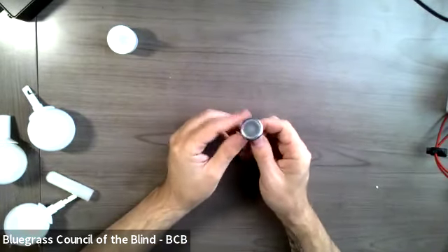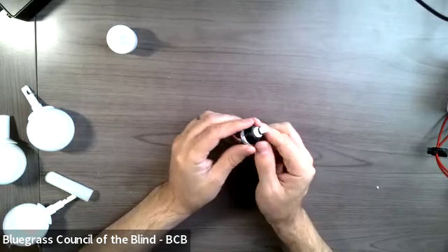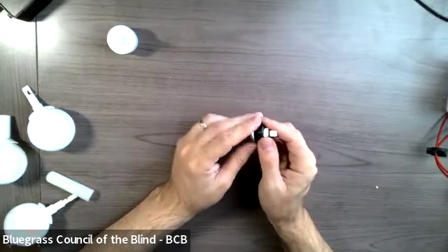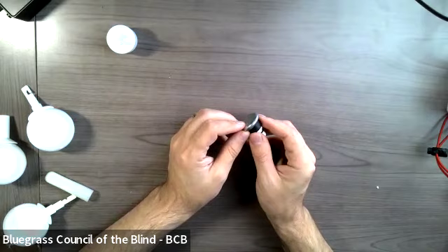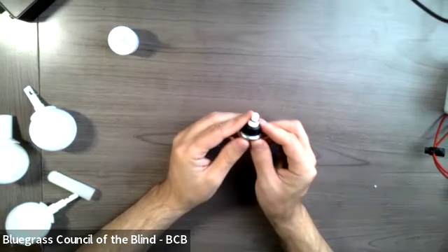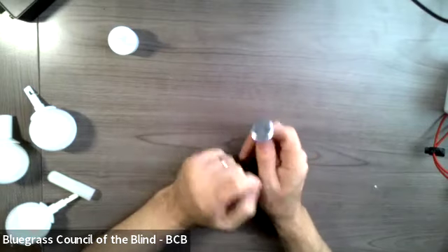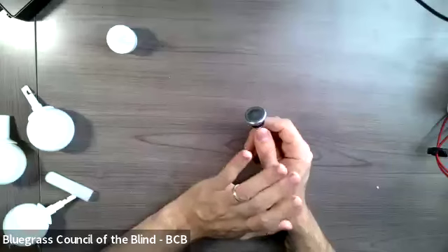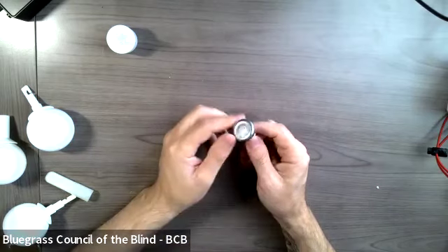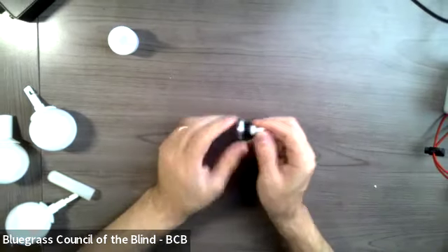Another option, which is my personal favorite, is the metal glide tip. This just looks like a coin at the end of a tip, and it's made out of metal, so it is extremely durable, and it's called the glide tip because it tends to glide over most things. This particular one is a screw on, but I have a hook style on one of my canes. I'll show you that here in a second. But I just love this because it glides wonderfully over hardwood floors, over linoleum, over carpet, works pretty well over things like concrete and asphalt, and just glides really, really nicely.